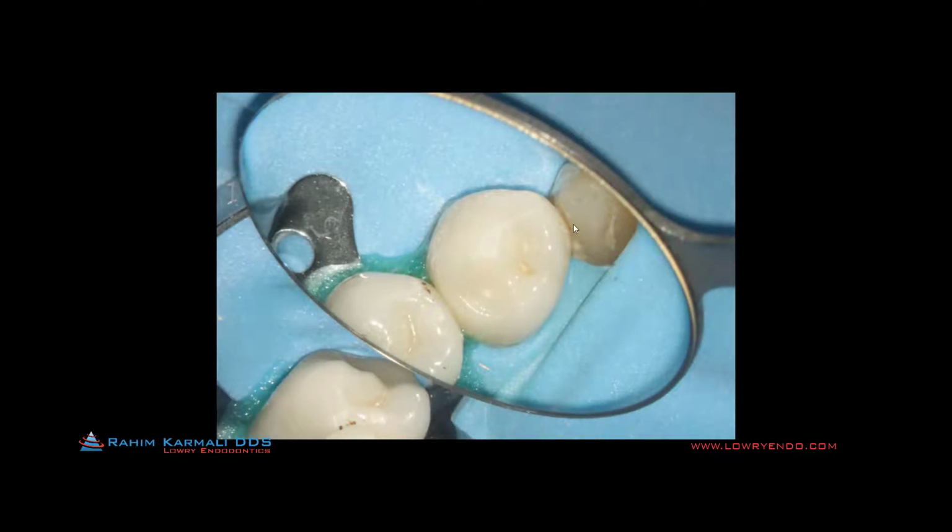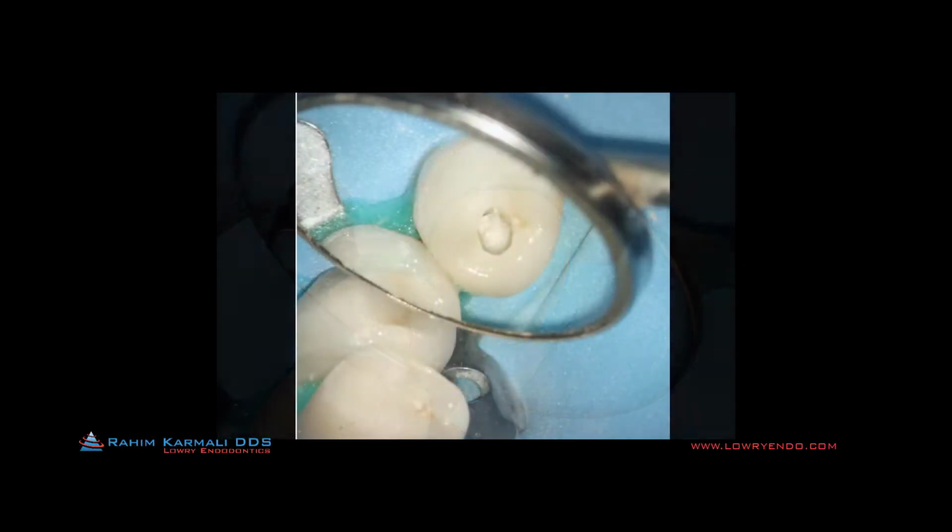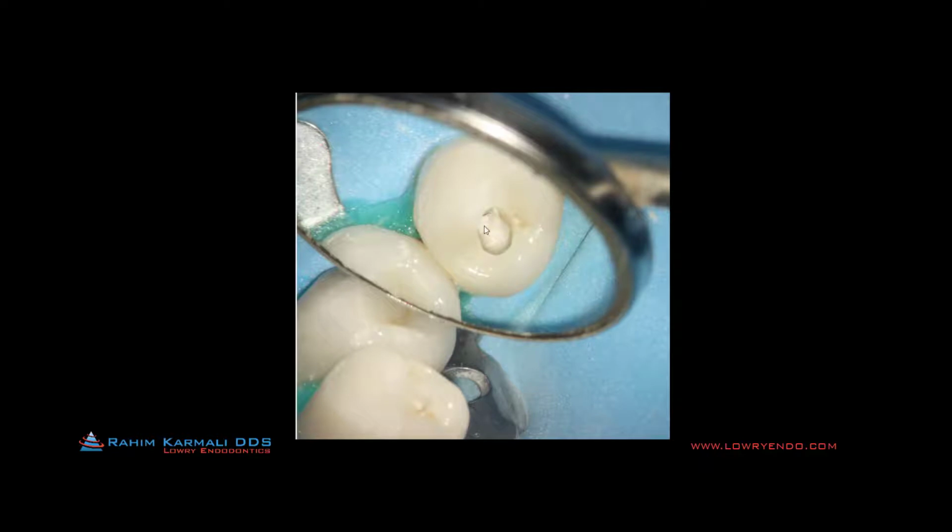This is isolated. It's an all-ceramic crown, so we're going to go through it very carefully with a round diamond burr with lots of water. We're going to try to preserve this crown, and we don't want it to fracture. As soon as we access through the crown, we hit a layer of Cavit, a temporary material, and then we see the retained cotton pellet. And so the restorative endo transition probably could have been managed a little bit better.